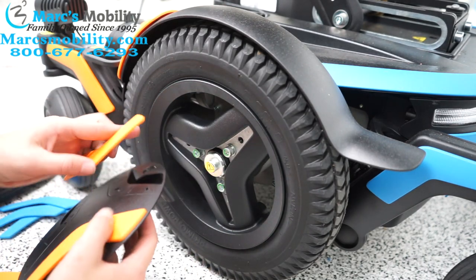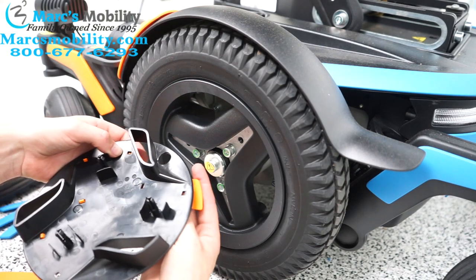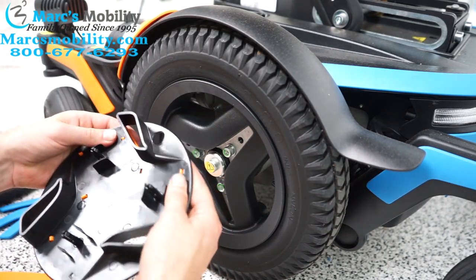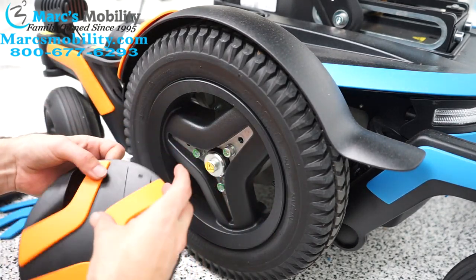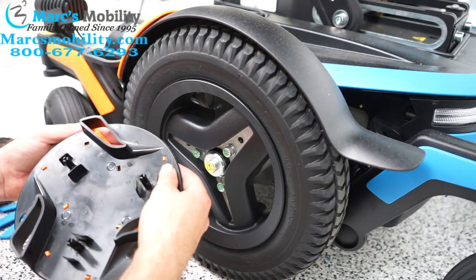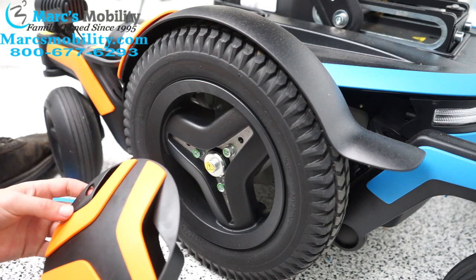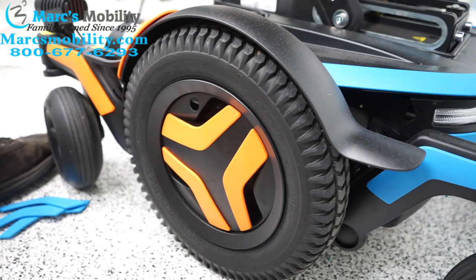Here's our first one. Second one. Then our last one is going to go like this. Now that our new shrouds are in, you just kind of line this up, spin it until it goes in, and then you snap it in.